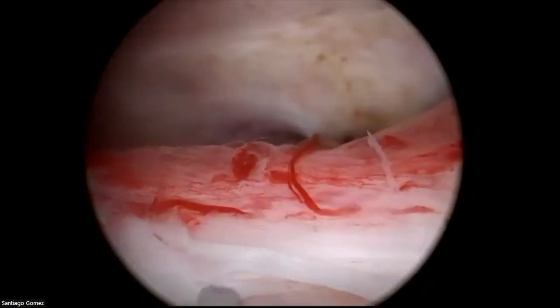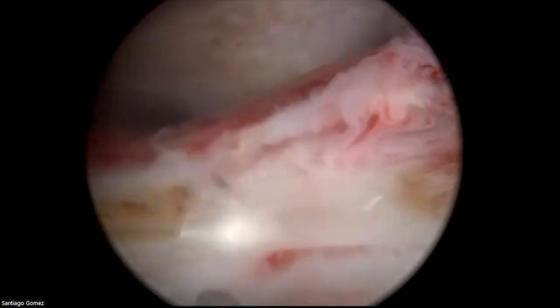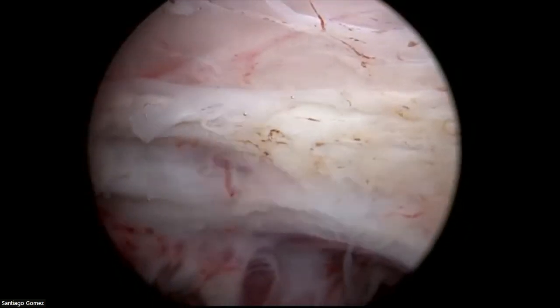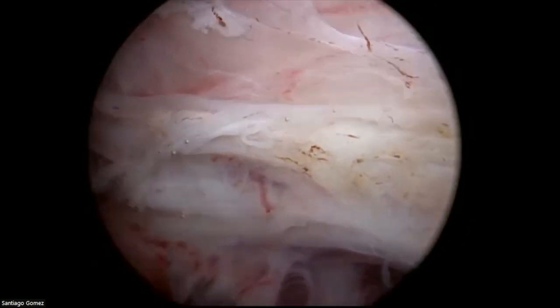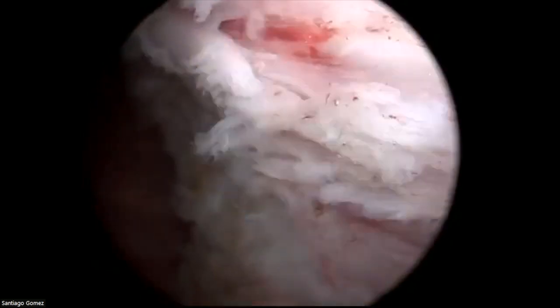Okay, so I'm going to try to morcellate. Of course, with a perforation, I will keep my bags relatively low. They are not so high. Okay, so I'm going to do the change of instruments.